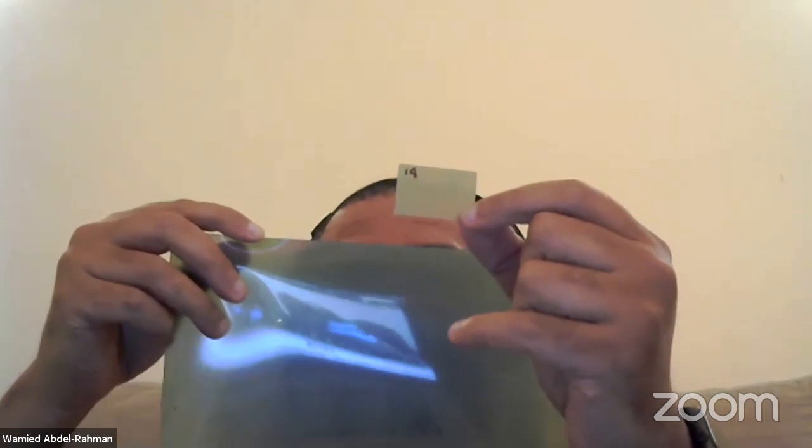So we will put the longer side parallel to the longer side of the scanner. This is just to make sure that we're doing things in a consistent way.